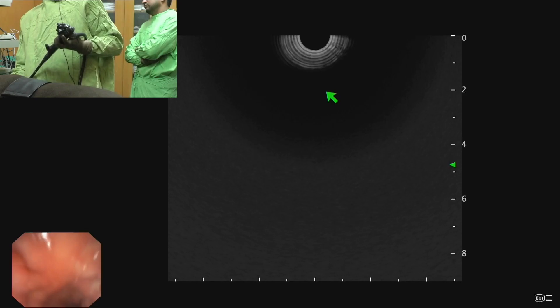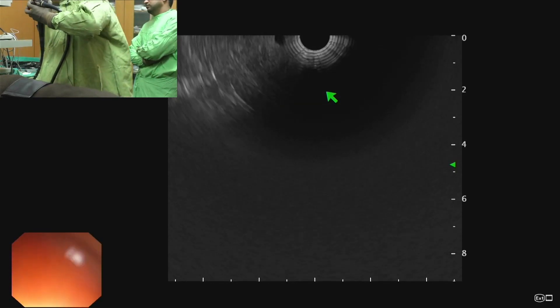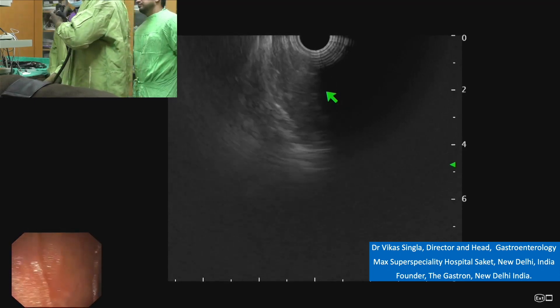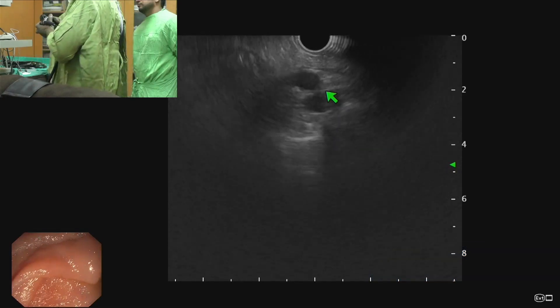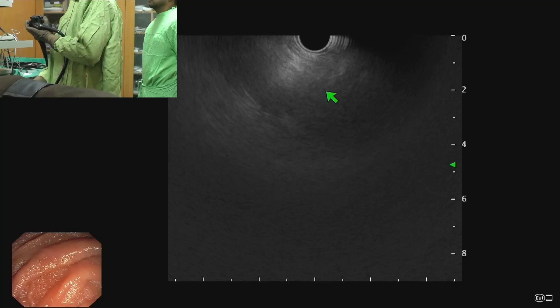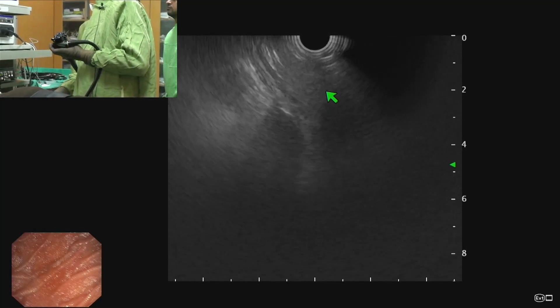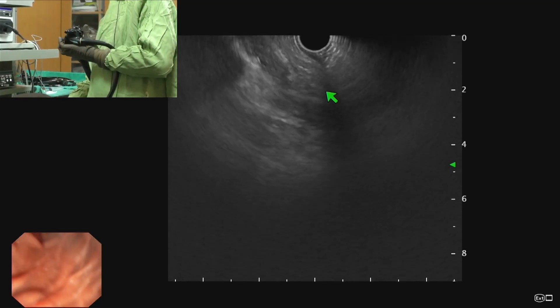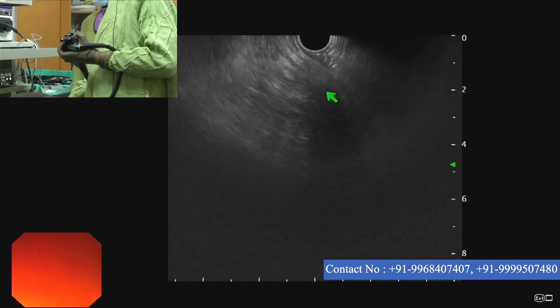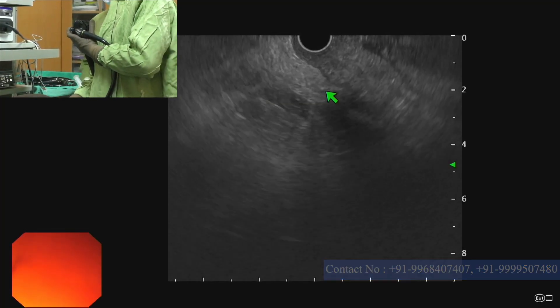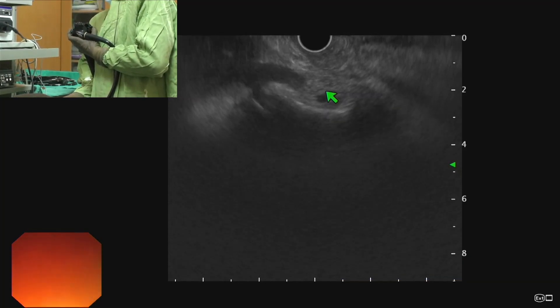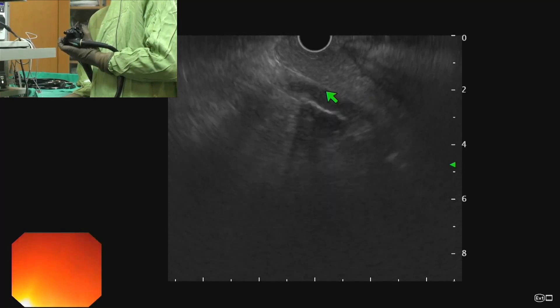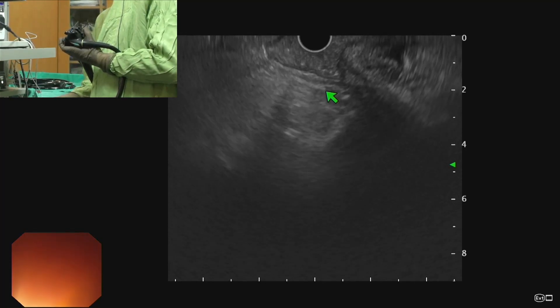The next station is the second part of duodenum. We shorten the scope from the first part of duodenum — we see the roof, localize the roof, and gradually shorten it. We have shortened the scope. Now we suck all the air. If I rotate anticlockwise, I should see the left circle; we will see the right circle.